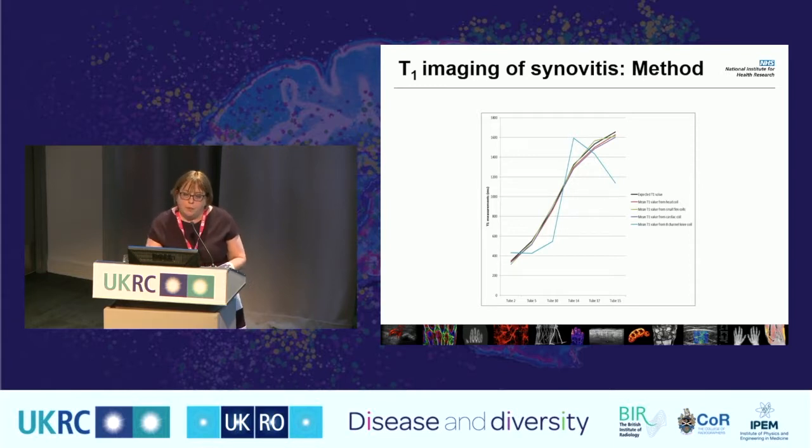Well, that's great because it holds the patient in the right place. We can make sure that the patient's isocenter is in the middle of the magnet as much as we can. But the problem with the knee coil is that it's a transmit and receive coil, and that inherently has a dreadful uniformity of the magnetic field. Now, for those clinical imagers in the room, that doesn't make any difference to you whatsoever. Your images will be what they be. But if you're looking at empirical quantification, it is a nightmare.